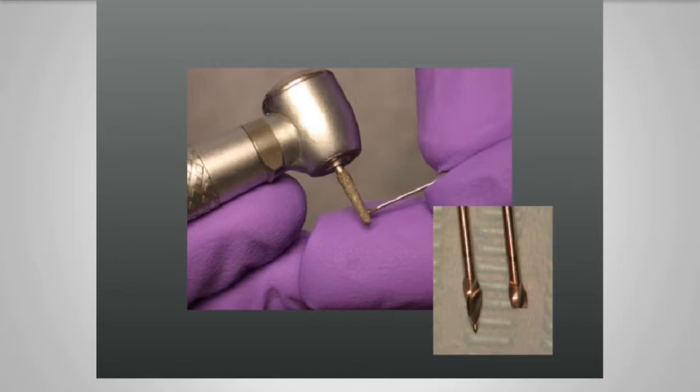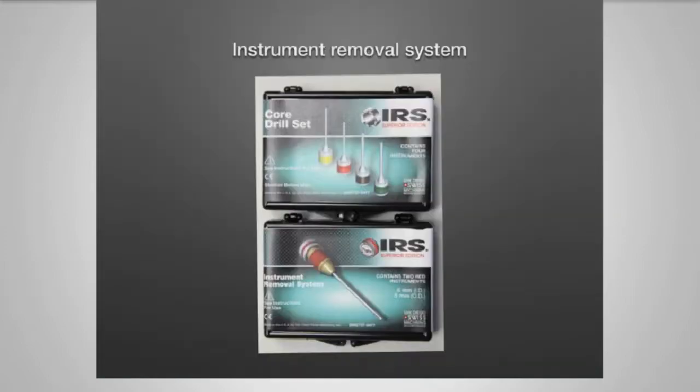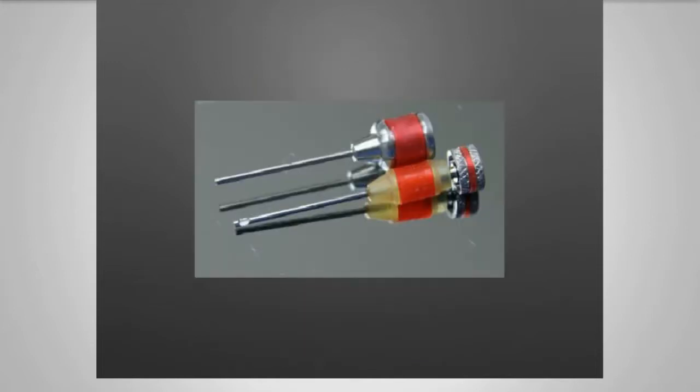The instrument removal system is an excellent way of retrieving the loosened pieces of fractured instrument. You'll see this in action in a minute. This comes with core drills, which can be used similar to the Masserann trephine to cut gently around the piece of fractured instrument, and then a remover, which consists of a tube with a little window in it and a rod down the middle which grips the piece of fractured instrument so you can retrieve it.